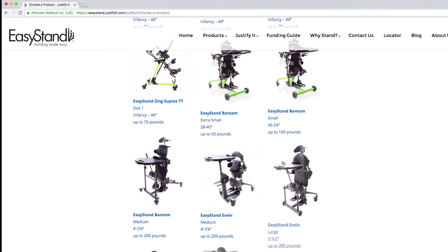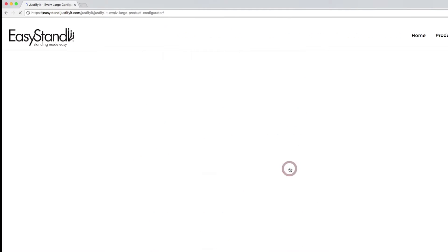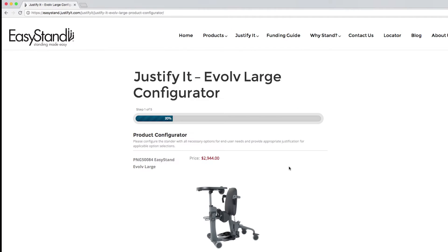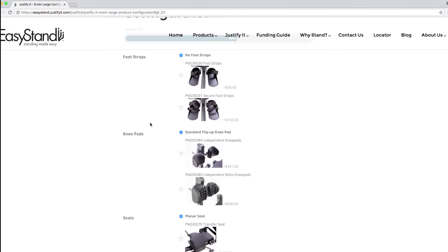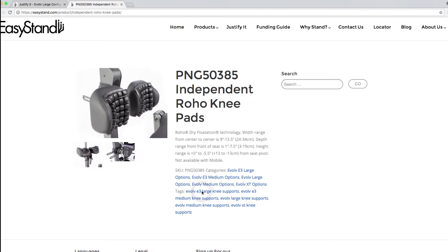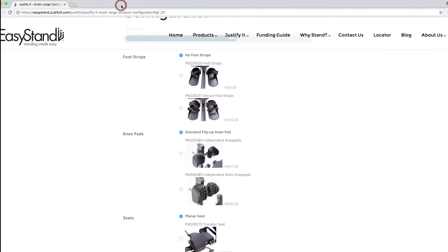The configurator will then ask you to choose the components that you need. Any time you need more information about a product or an option, simply click on the picture. Close this page when you're done reviewing the information. This will bring you back to the configurator page.